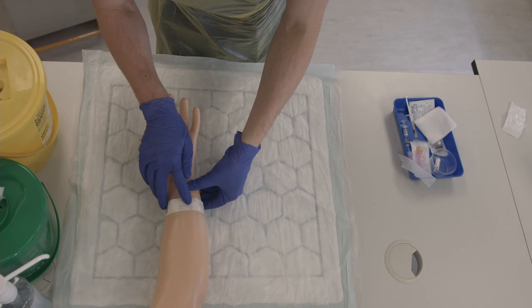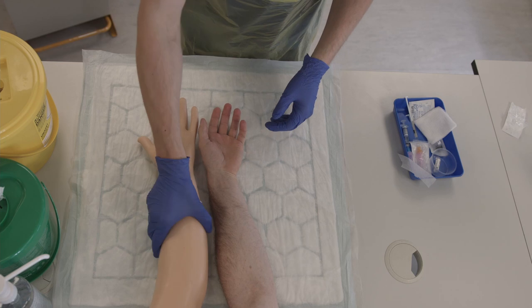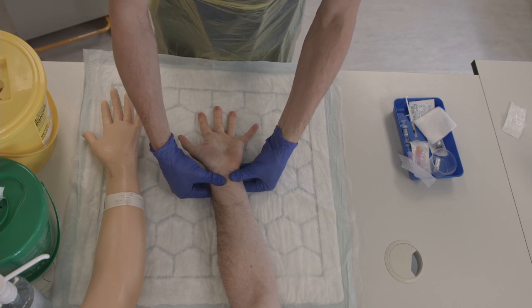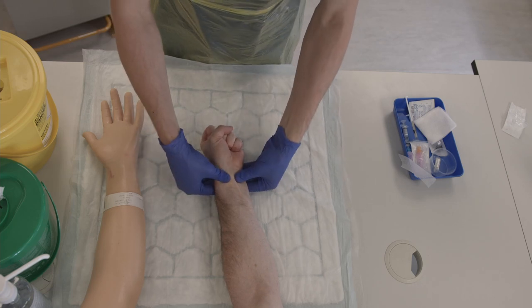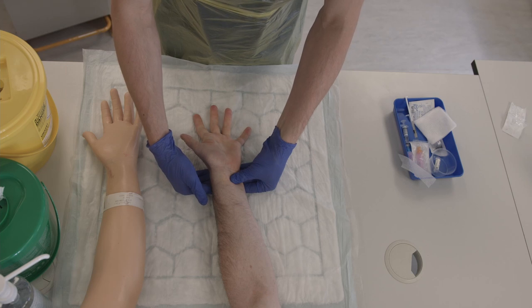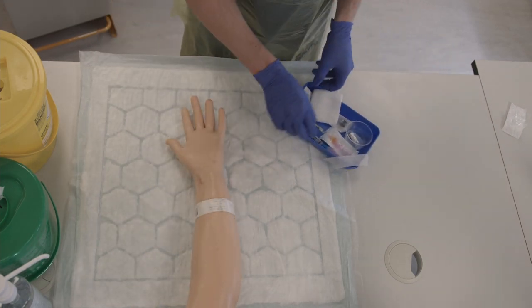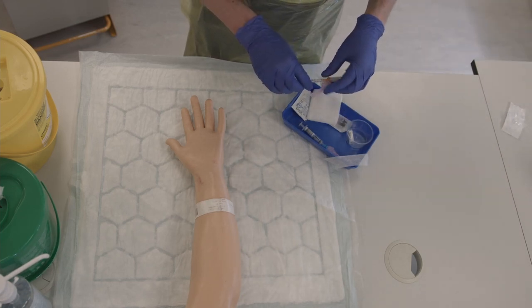Check the patient's name and date of birth. You may then be asked to perform a modified Allen's test. Ask the patient to clench their fist, then occlude the radial and ulnar pulses. Get them to relax their fist, then release the ulnar pulse — the hand should refill with blood. Then release both pulses and get the patient to clench their fist again. Occlude both pulses, ask the patient to relax their hand, then release the radial pulse — again the hand should refill with blood. This shows that the patient has a collateral arterial supply to their hand. You may proceed to take an ABG.